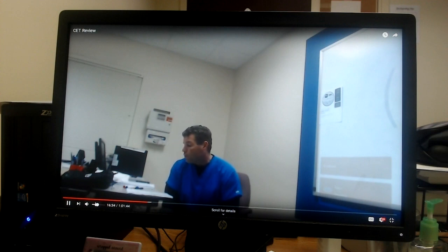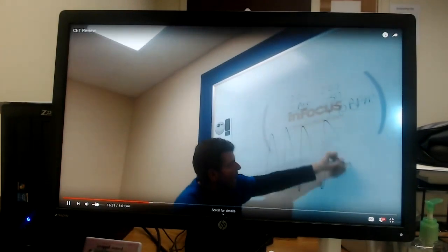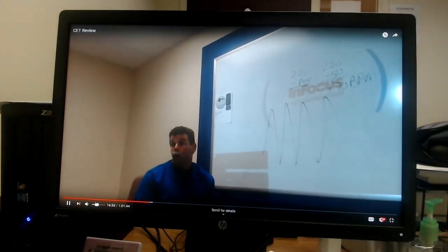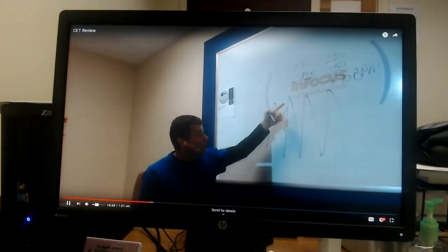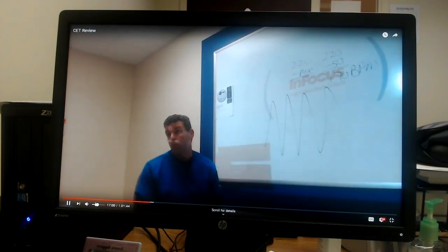38, which of the following rhythms is the PR interval absent? A, good, ventricular tachycardia, right. And VTAC, remember, it's just one wide bizarre beat after another. So there is no PR when all we have is one PVC after another PVC after another PVC. Let's see, 39.